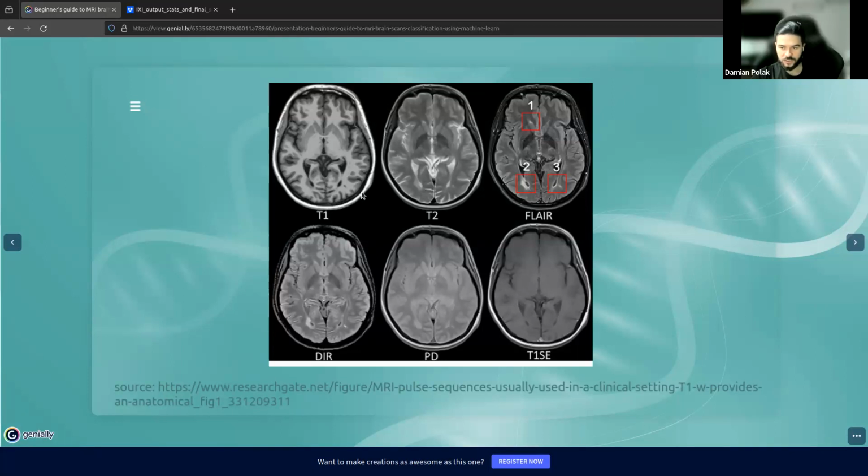However, be aware that it is impossible to extract tabular data only from T2 scans. You will need both T1 and T2 scans. Nonetheless, it is possible to use T2 scans with a ConvNet-based method after performing preprocessing steps.